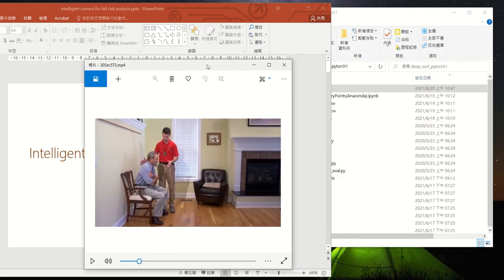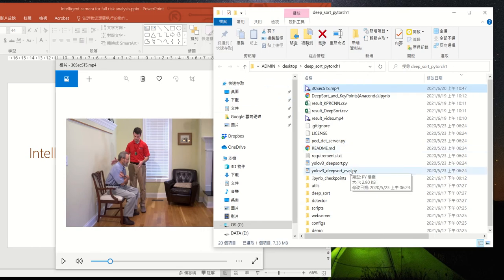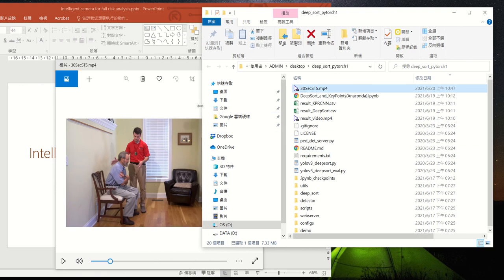Now we use DeepSort and KeypointsRCNN to extract the joints and the subject ID. Of course, if you can run the program on your own computer inside Anaconda, then you just run it. Suppose you want to test the technology and you don't have Anaconda installed, or you don't have GPU access, you can still run and test.